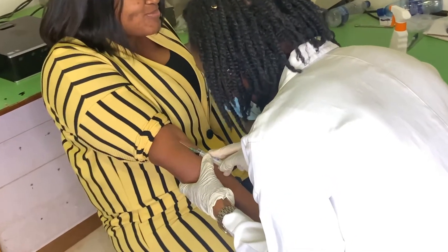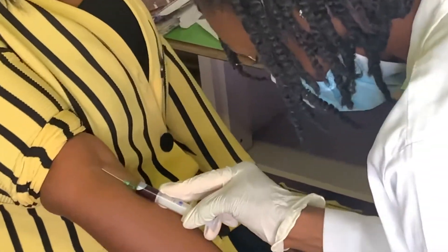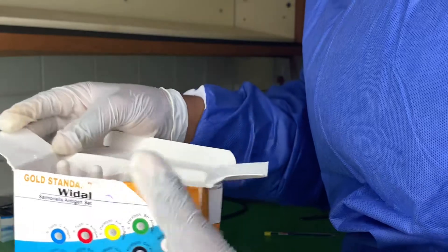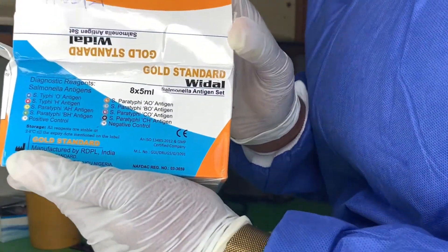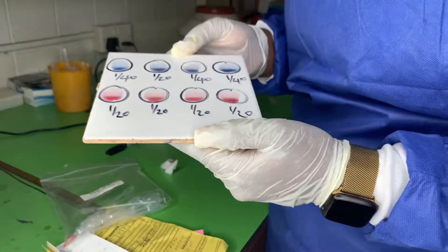Have you ever wondered what goes on behind closed doors whenever you go to a hospital or a lab to perform a Widal test, commonly called a typhoid test? Well, this is a 10-minute video walking you through the entire process.